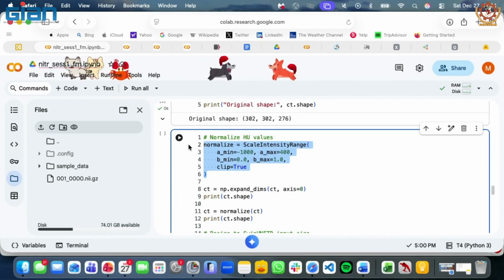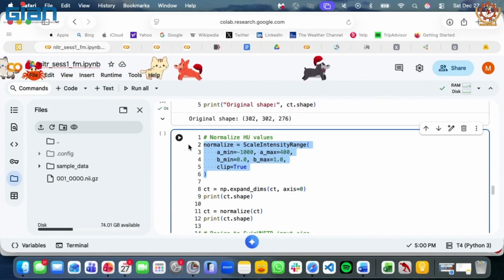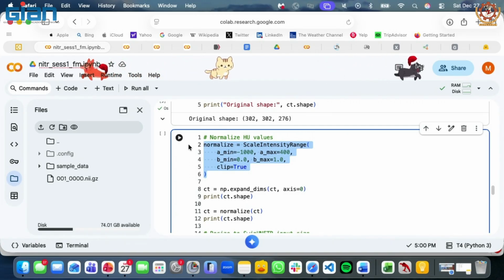And the soft tissues and organs will look different. You have pixel values; in CTs, you have Hounsfield units. For example, a very high dose CT will have very different intensity, and a low dose CT will have intensity on a very different scale. Again, to train a foundation model or even get the inference, the features, you need to normalize it.